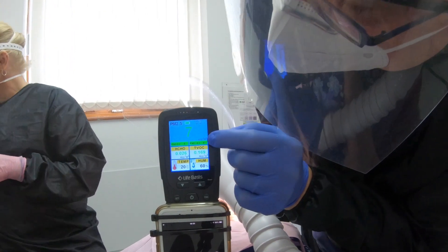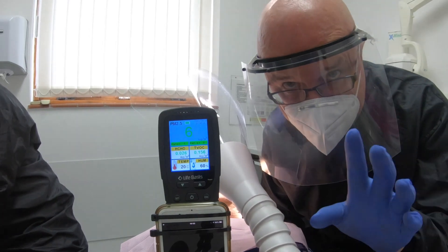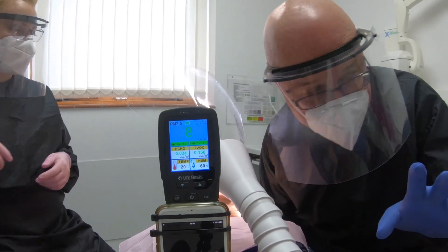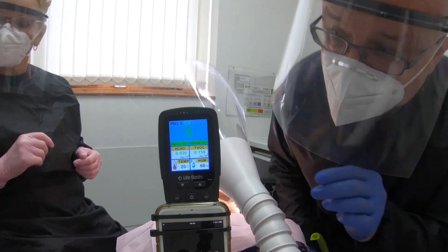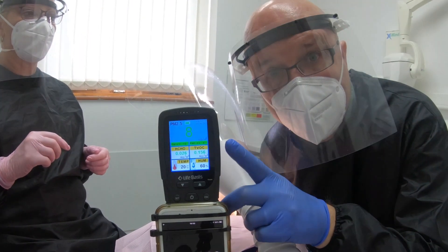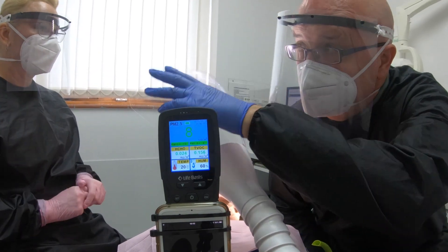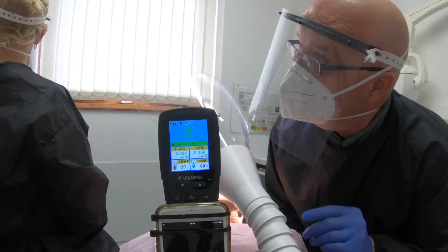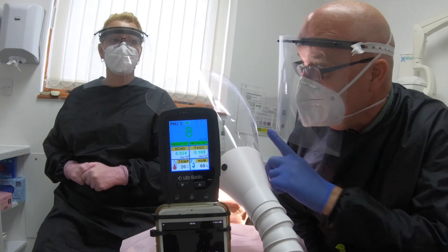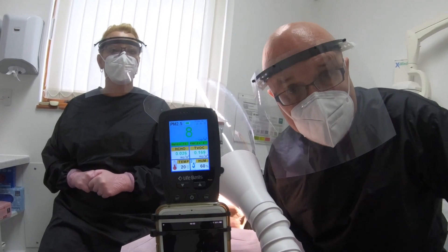But we are showing readings at the end of the AGP. Now remember, this is when we would be downing tools and starting our fallow time normally. So based on this, this is actually normal level straight away. With the dental air in position, the air purifier is showing some particulates in the air. It's just dropped to good air quality again. No open window so we're not going to freeze.